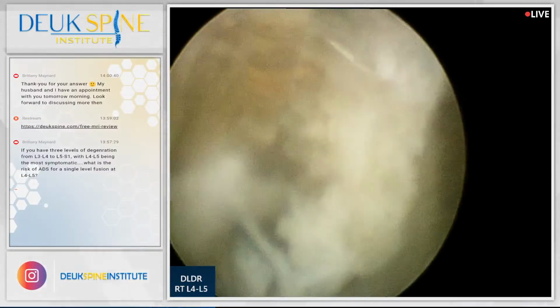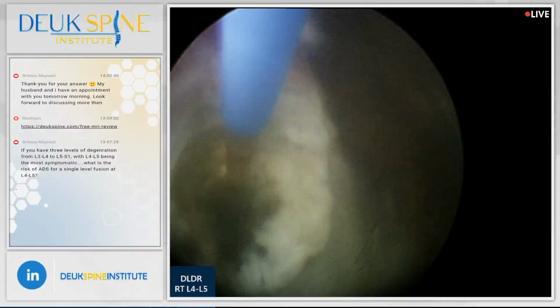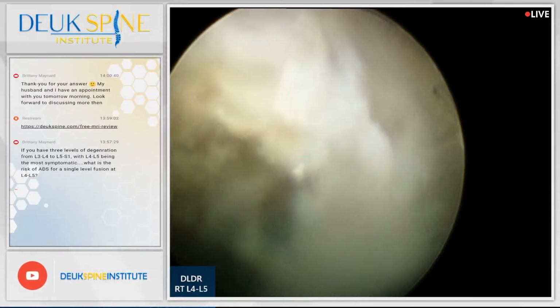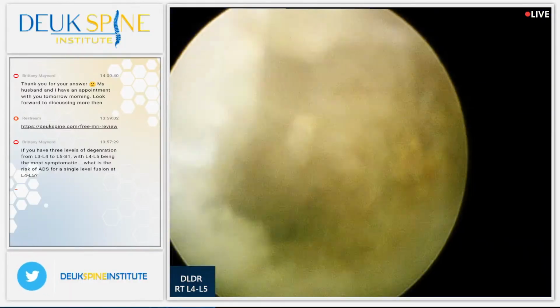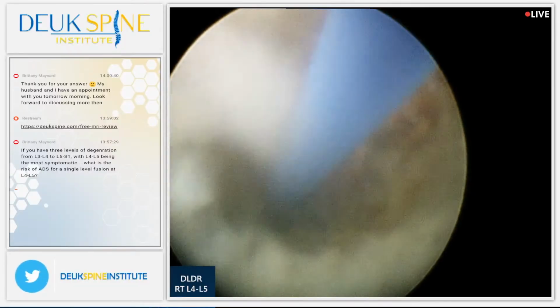Any other questions? At this moment, no current questions. So in the meantime, as we're finishing up, why don't we show the audience how it is that we cure herniated discs with this procedure? Back pain, from a herniated disc, of course. Then we'll be back to do the facet treatment, okay? So we're going to end the stream, but we'll be back and we're going to do his facets next.